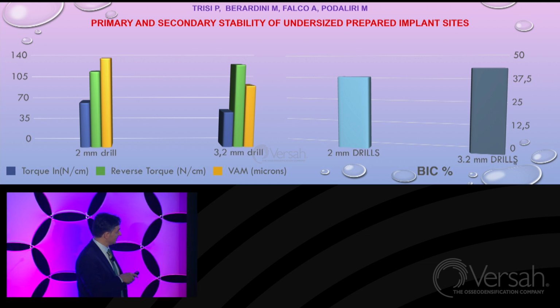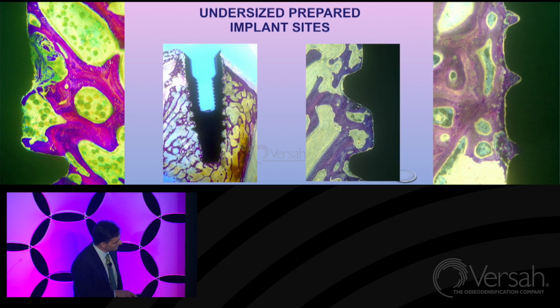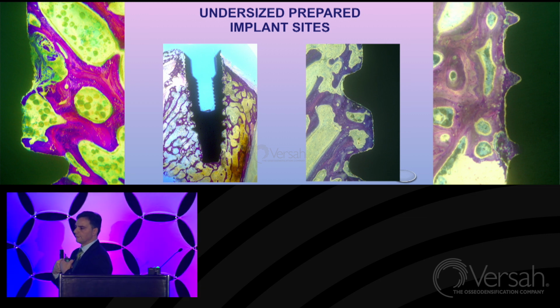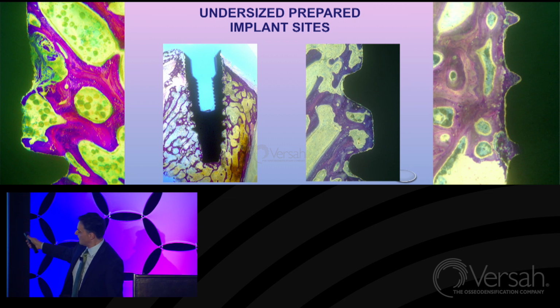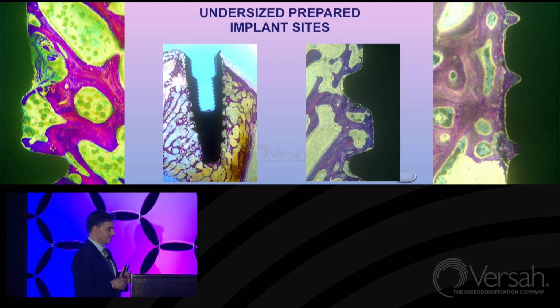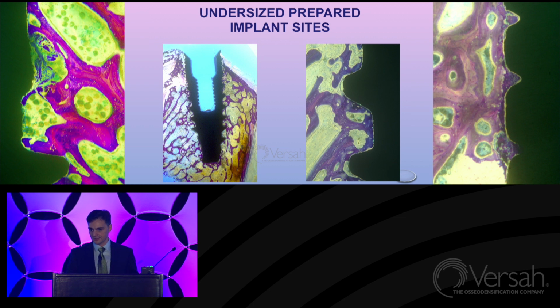This is what we find, broken fragments of the bone. And these broken fragments are compacted between the implant and the newly formed bone. This bone dust will remain there for months until the next remodeling cycles, which can take even months. This could be the reason why we find these differences, this reduced strength of the undersized preparation.